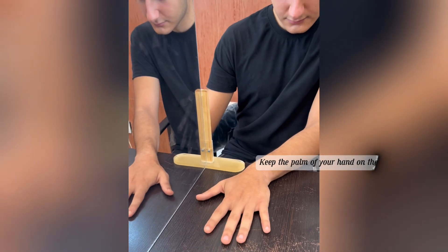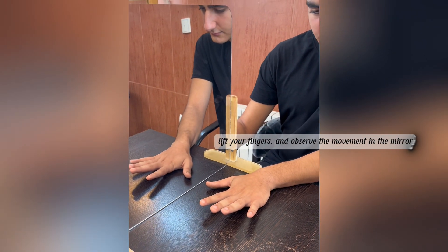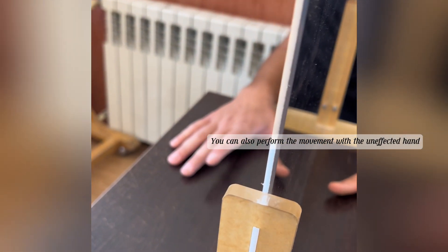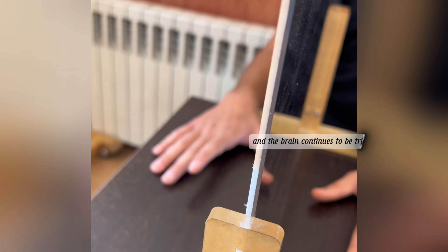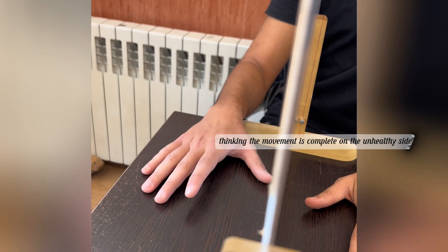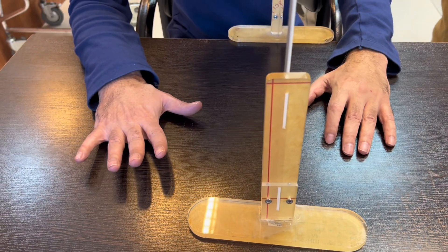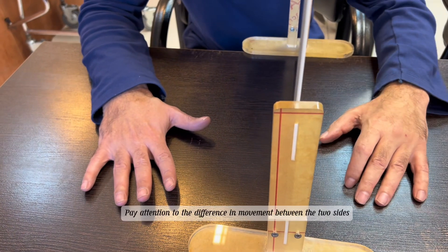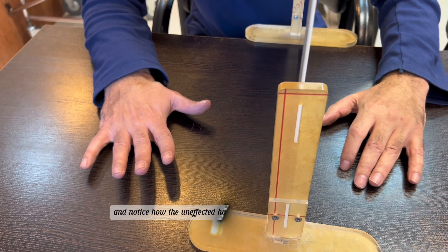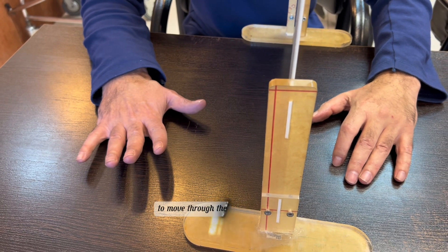Keep the palm of your hand on the table, lift your fingers, and observe the movement in the mirror. You can also perform the movement with the unaffected hand, and the brain continues to be tricked, thinking the movement is complete on the unhealthy side. Pay attention to the difference in movement between the two sides and notice how the unaffected hand encourages the affected hand to move through the brain's connection.